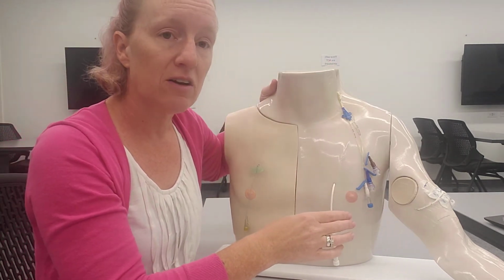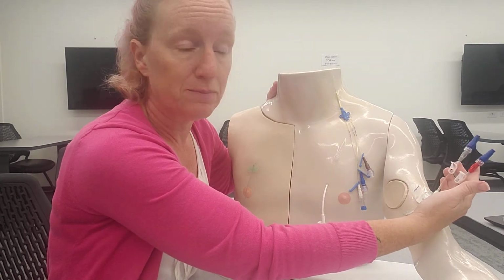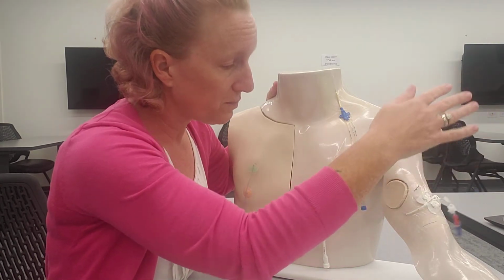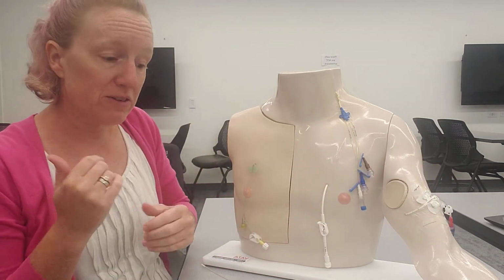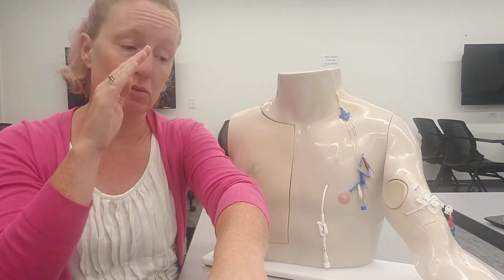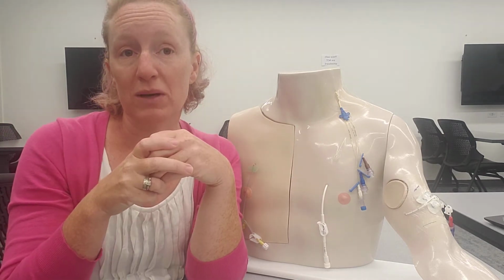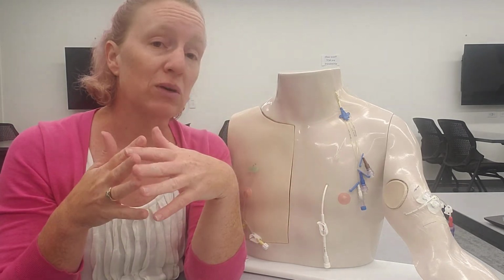And then our little Chester chest does have an example of a PICC line with 2 ports here, or 2 lumens. And so that's something that we will see. We have to make sure that we're taking care of each lumen separately. It's like having multiple IV sites, you would take care of each spot. Anything that is going into your patient or connected to your patient is really important that you do documentation and look at and take care of, because it's still your patient. Even if that's not in your scope of practice, you still have to be aware of it.